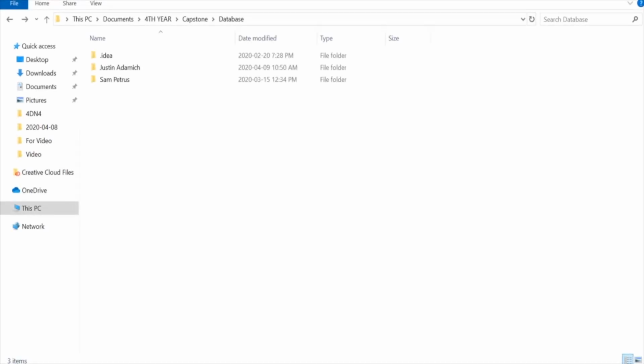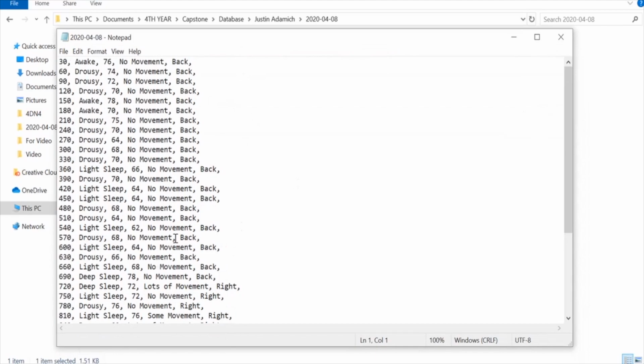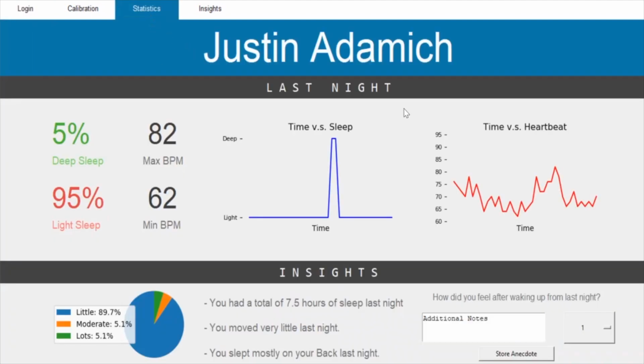Once the data has been captured for a given night of sleep, it's stored under their user profile in this log file here. Now what the user can do is log in to the interface here. They type in their username and password. If it's the incorrect password, they aren't able to continue and look at some of the statistics just yet until they type in the correct password. It will say login successful, and we can go to the statistics page here.